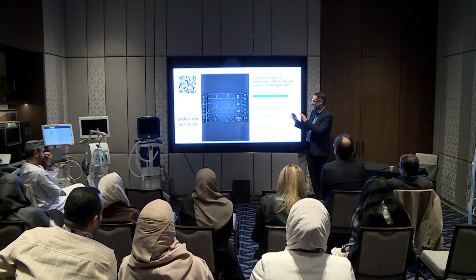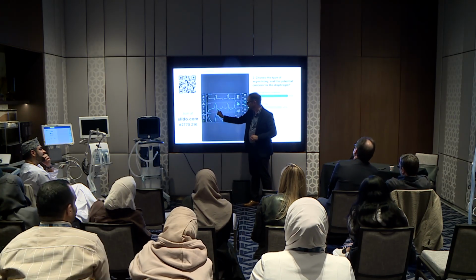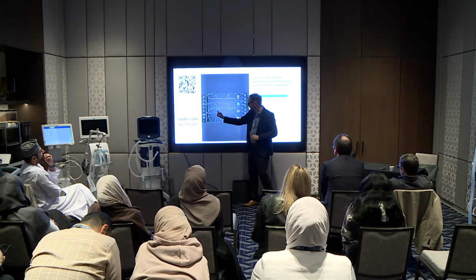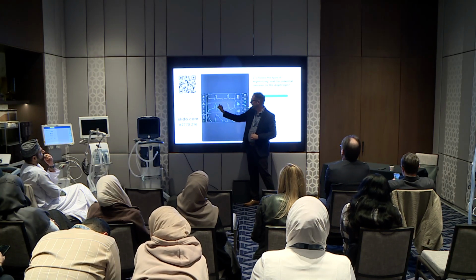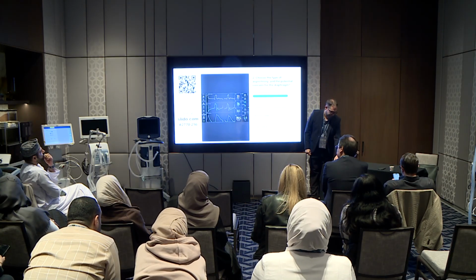Again, for those who may have voted but are still unsure: the ventilator is triggered, gives the breath, cycles off. You see evidence immediately, a deflection in expiratory flow towards baseline. That means ongoing activity. So the contraction started here. That's a concentric contraction. It continues on. That's partially eccentric. Therefore, we have the post-inspiratory loading.